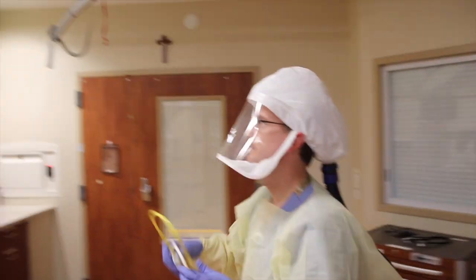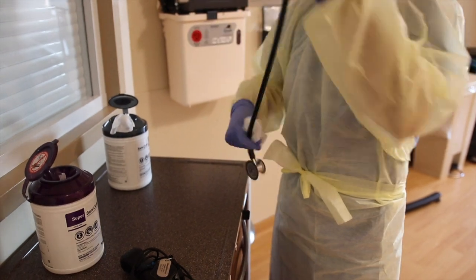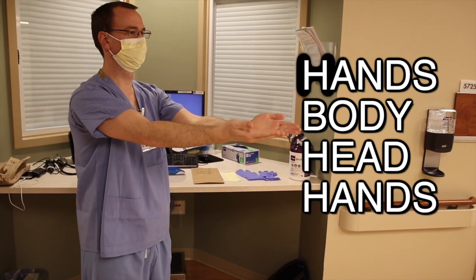Once you are done seeing your patient, the first step, as usual, is to leave a stethoscope inside the room if it is disposable, and then wash stethoscopes or any other equipment you've brought into the room with sanitizing wipes. Set them aside 6 feet from the patient in a clean area. The order of removing PPE gear is similar to putting it on: hands, body, head, hands.